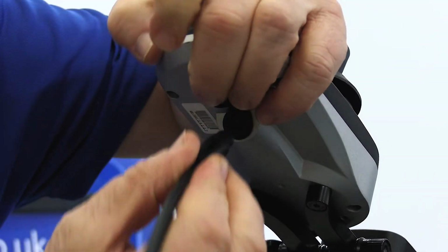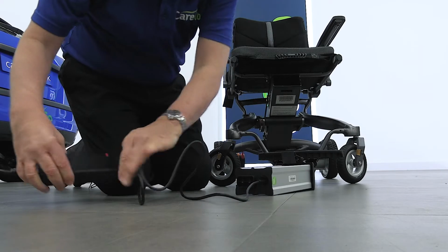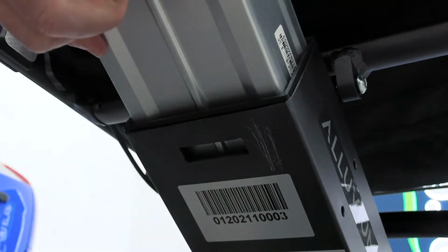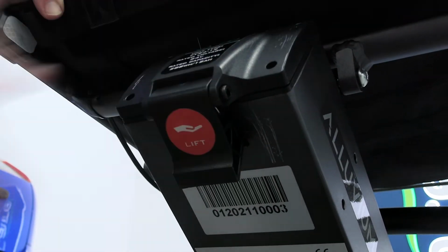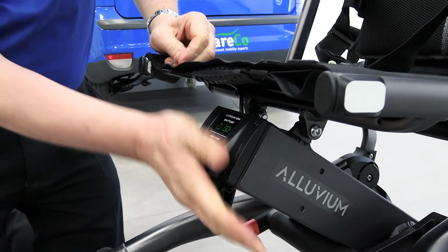The chair's battery can be charged through the port on the underside of the handset or directly into the battery itself. When either removing or inserting the battery from the main rack tube, lift the handle on the battery to make sure it's unlocked. The handle will click on the tube when it's securely in place.